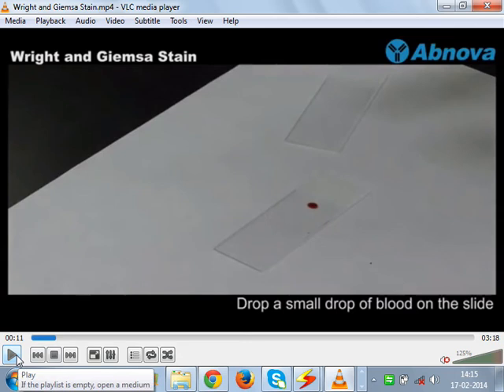That comes only by trial and error. I have to make smears many times. No experiment you can master by doing it once. Shall we continue? Yes.